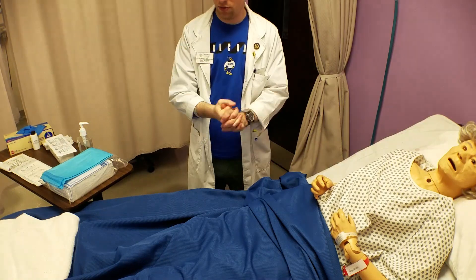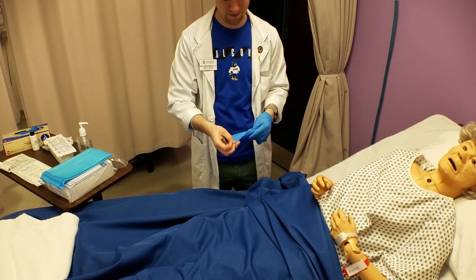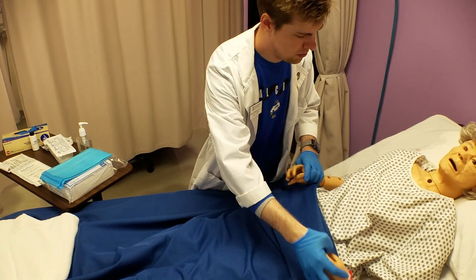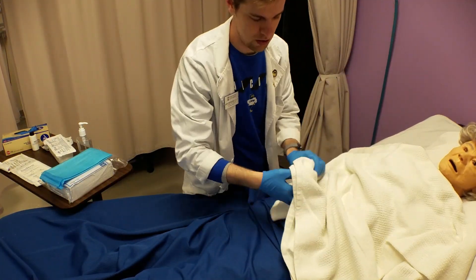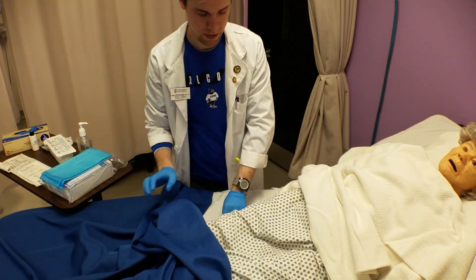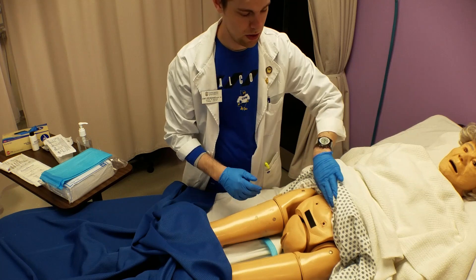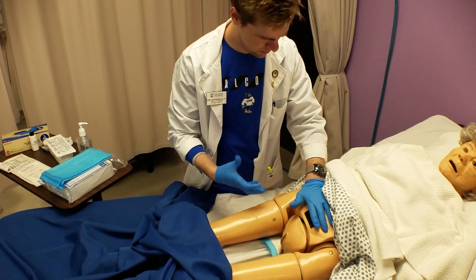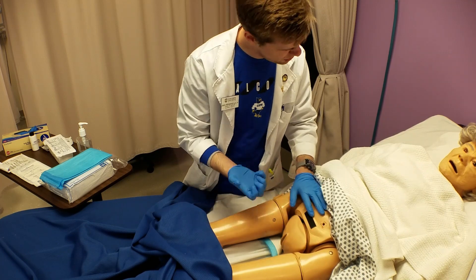You may then apply clean gloves and begin a lower abdominal assessment while the patient is supine. Try to keep the patient as covered as possible at all times — this helps provide privacy and keep the patient warm. Visualize, percuss, and palpate the suprapubic region. What we do next is determined by whether we are dealing with a female or male patient, and if we are doing an indwelling or straight catheterization.